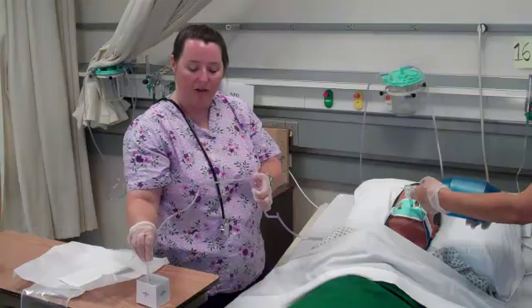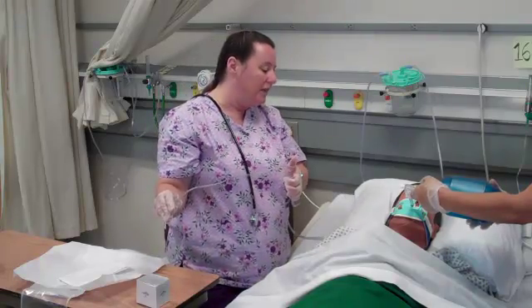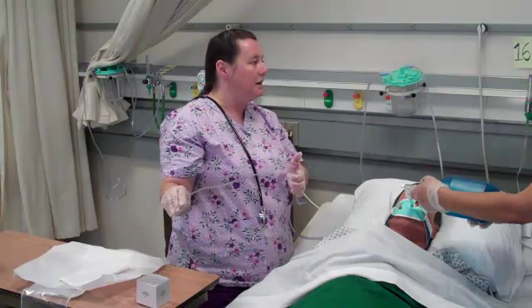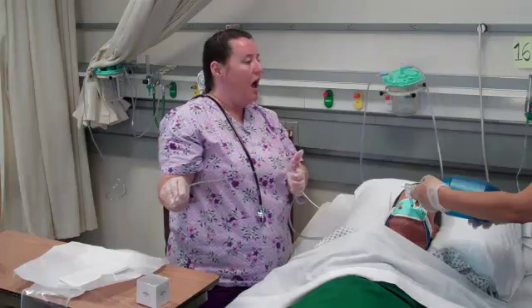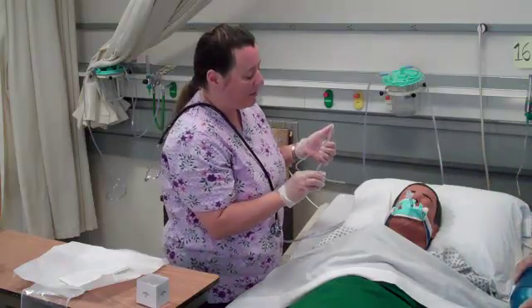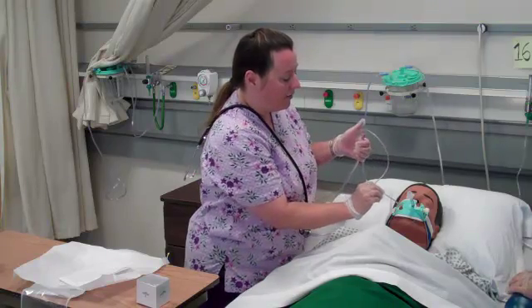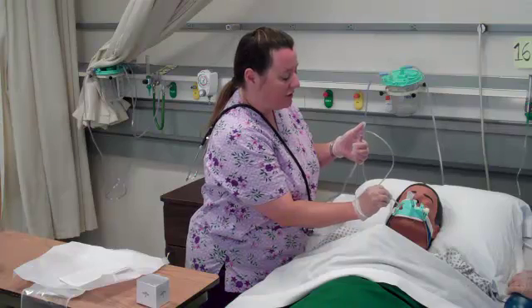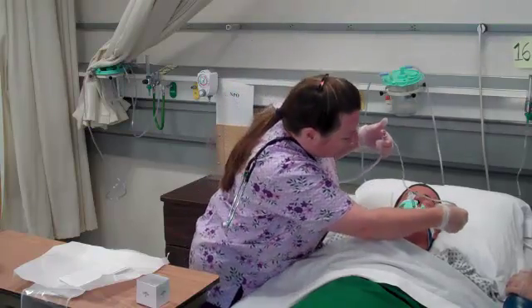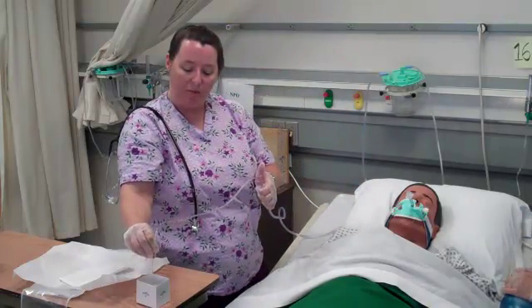Kathleen is applying supplemental oxygen. I'm going to reassess my patient — he appears to be breathing easier with less agitation. Looking at the monitor, his O2 sat has returned to baseline and his heart rate is back to baseline as well. Kathleen can put the patient back on the ventilator. Now I want to assess the oral mucosa to see if it warrants suctioning of saliva and secretions. This is a clean procedure — the oral cavity is not sterile — so I apply intermittent suction around the oral mucosa. I'll clean the tubing before ending the procedure.